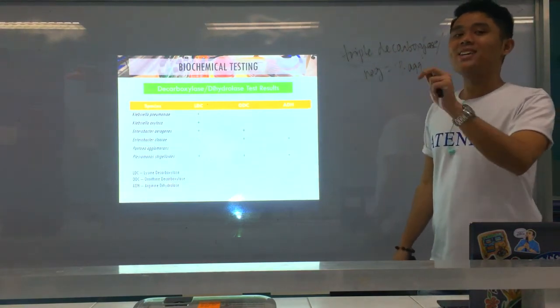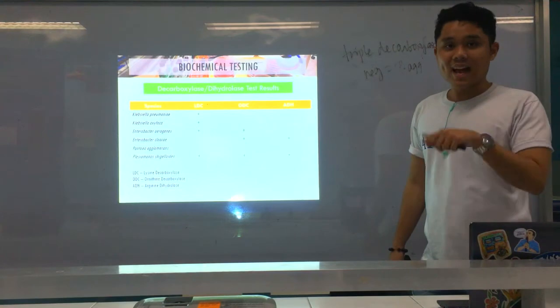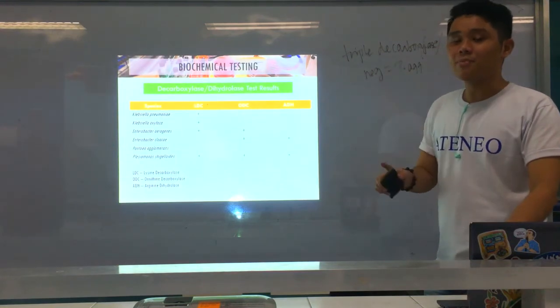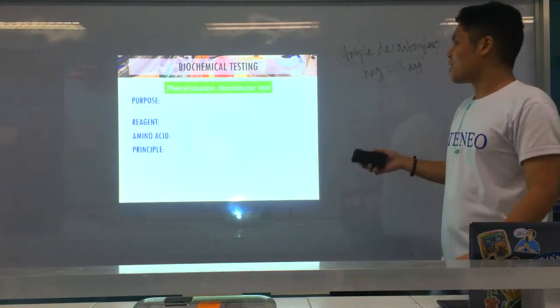Okay? Again, Enterobacter aerogenes, sa A ra siya negative. Enterobacter cloacae, sa L ra siya negative. Okay? Alright. Ayan. And sa kanina test, ang maka-differentiate sa Kleb pneumoniae and Kleb oxytoca, indole. Wag na mag-isip. Okay. Alright.